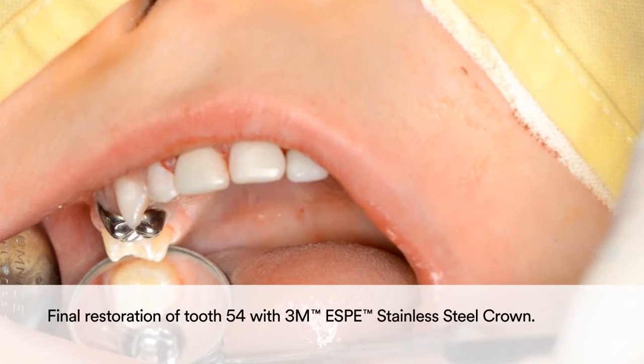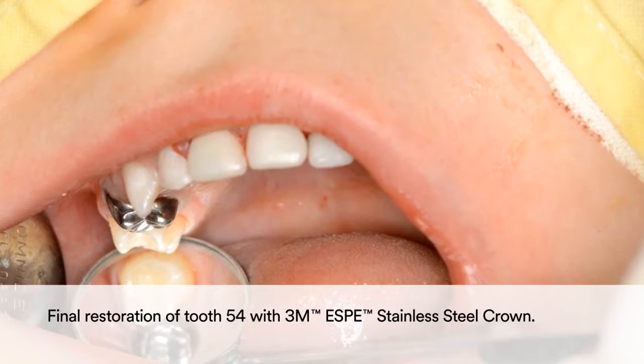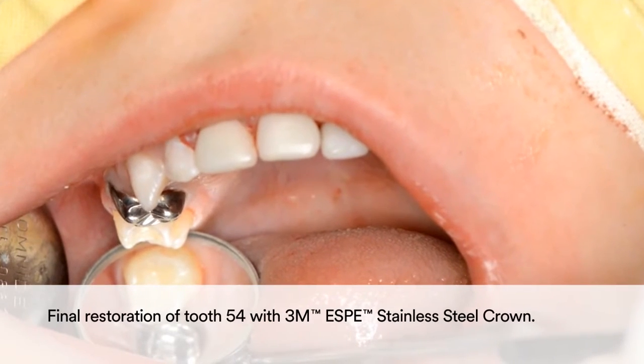The result is a quick and simple yet long-lasting restoration of tooth 54 with the 3M Stainless Steel Crown.